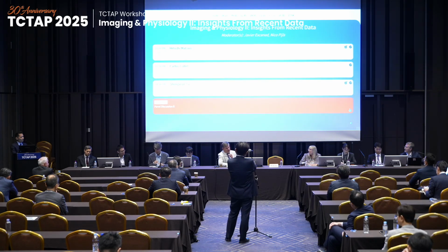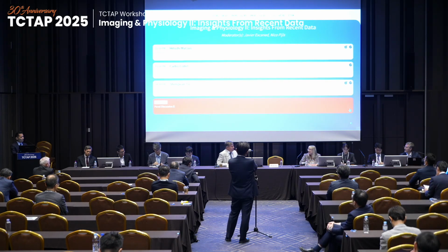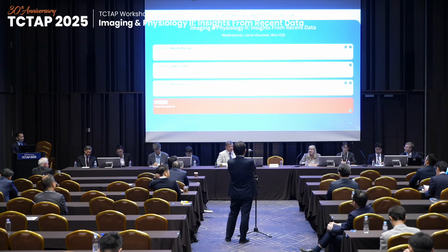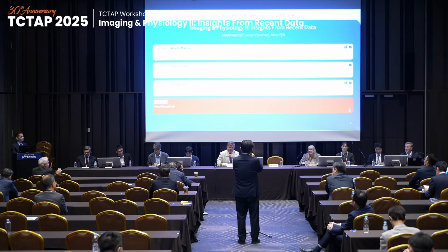That's my personal opinion. But I think that is also supported by the J-PRIDE. If you look at the conclusion of this J-PRIDE, it says, if there is discordancy, then you should trust FFR. But of course, you only know that there is discordancy if you have measured them both. So you can better say then, you should trust FFR. That's a simple statement. And that's more or less recognized in the American guidelines, but not in the European guidelines. Jung-Min, you returned, and you have the last word.